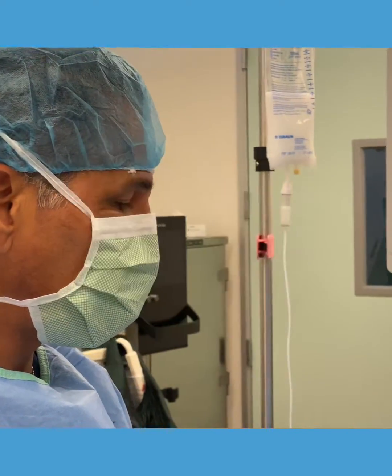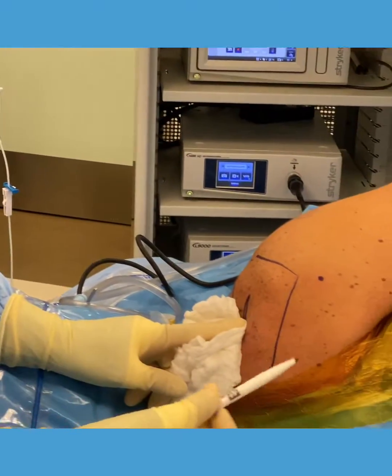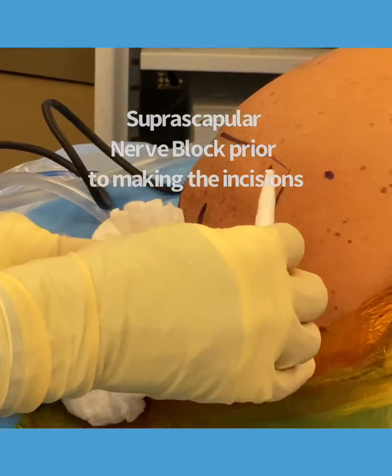Mario here. I just want to show you how I start my case. Before I actually do the arthroscopic procedure on a shoulder, I do what's called a suprascapular nerve block. And before I do the block, I outline my anatomy.